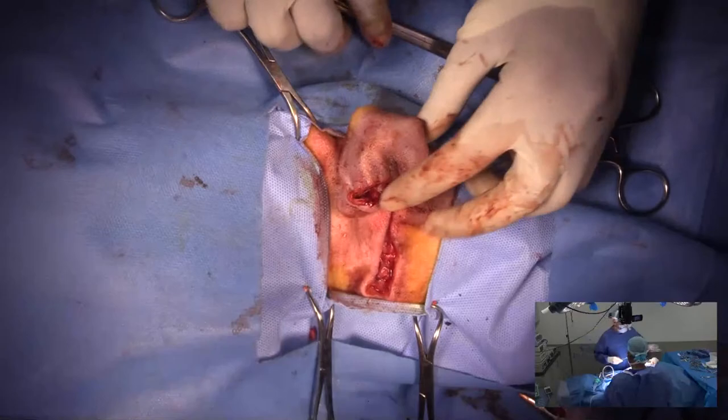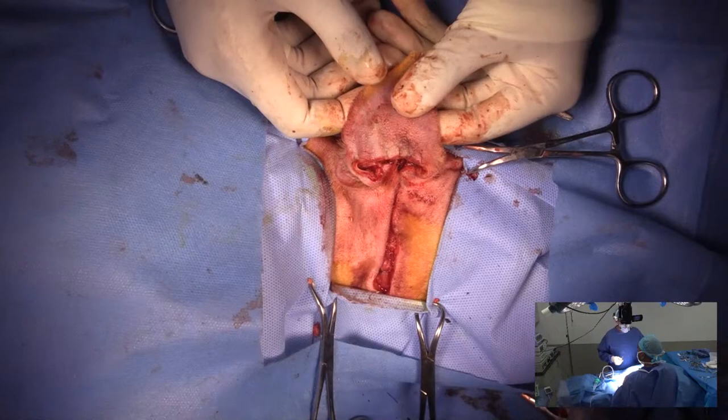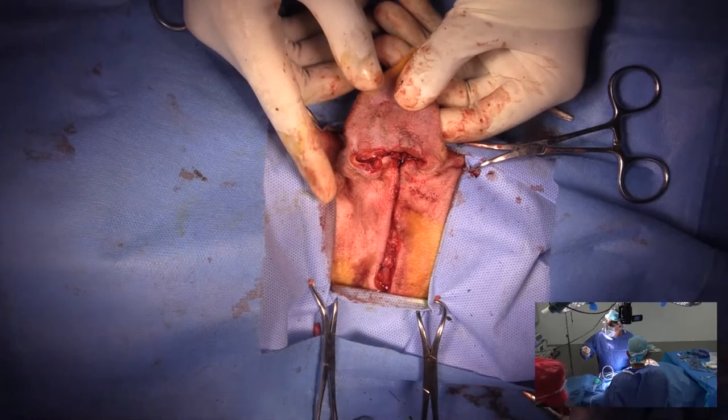Another one, will this patient have any vestibular signs after this procedure? So the question, will it have vestibular signs? And I hope not. I have stayed away from the dorsal aspect of the bulla, and hopefully that's prevented me from damaging the vestibular apparatus. Can I get something? Do we have something on a cutting needle? Maybe monosyn, 2-0 monosyn?